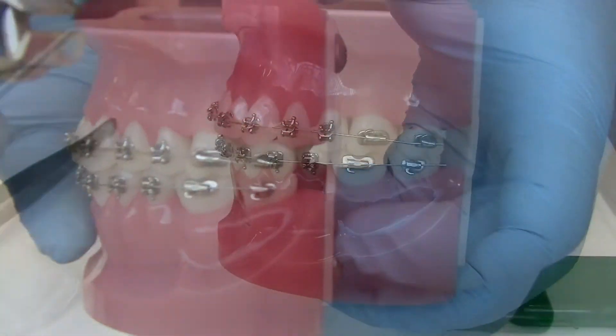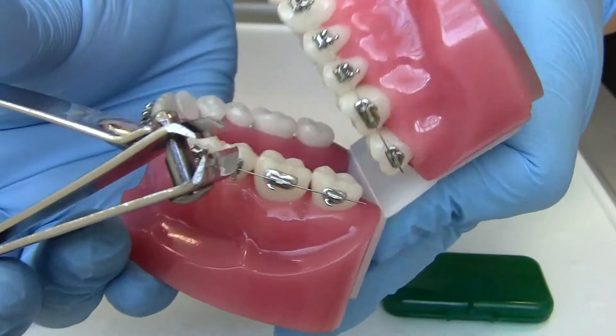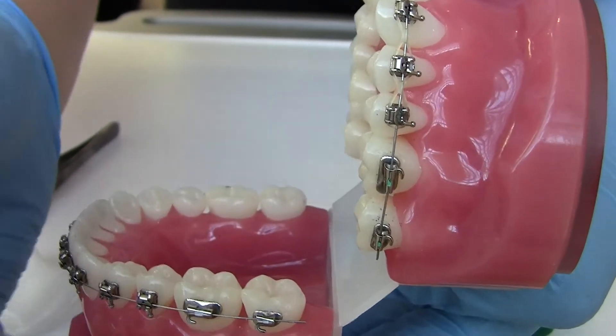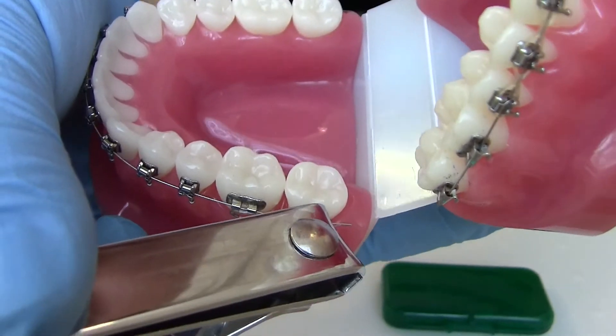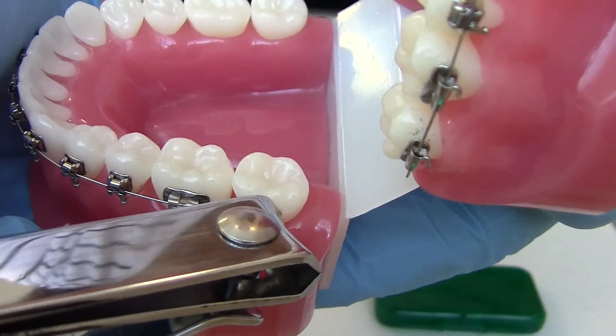When cutting, try to cut as close as you can to the bracket. Have a pair of clean tweezers on the side in case you need to pick up any excess wire pieces. This should stop the wire from digging into your cheeks and causing discomfort.